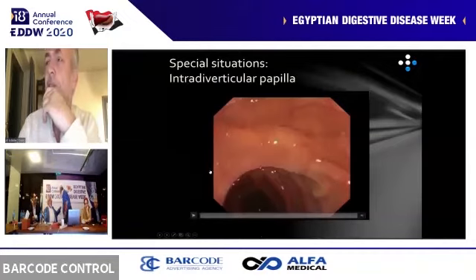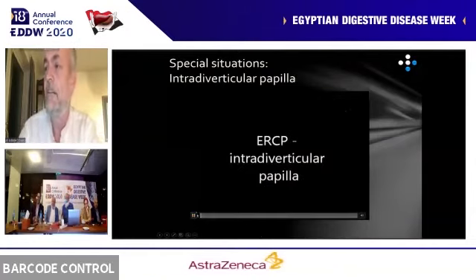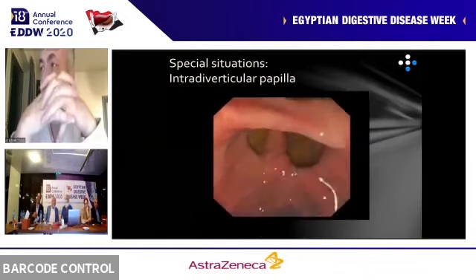But I would just finally mention a few special situations like intradiverticular papilla, because that's not all that rare, particularly in elderly patients.